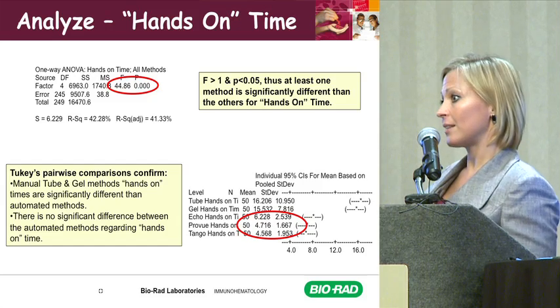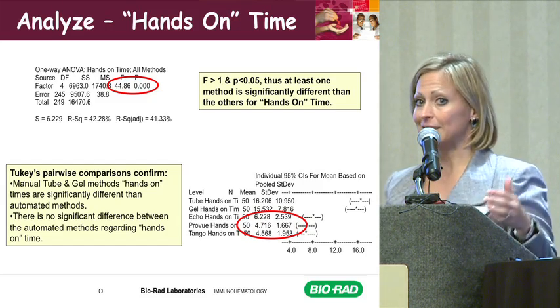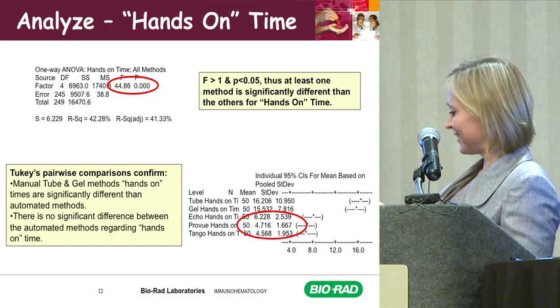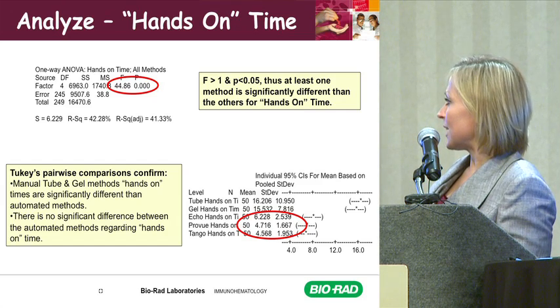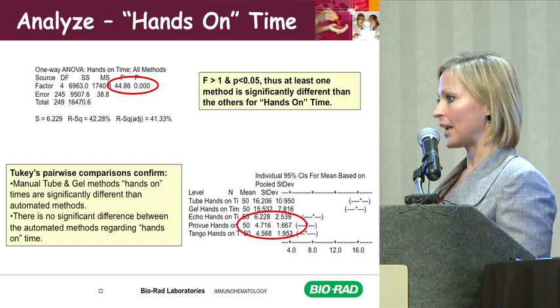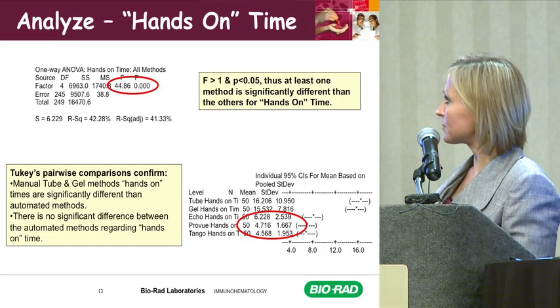I really want to get the workflow patterns similar. And hopefully someone out there has another analyzer that they would be willing to share, so we could get some comparable data and do another, better study with more time. But I have to say, even still, the Tango had the shortest amount of time hands-on. They had a little more variation, but you'd expect that if they have a higher workload. I would expect that based on my experience.